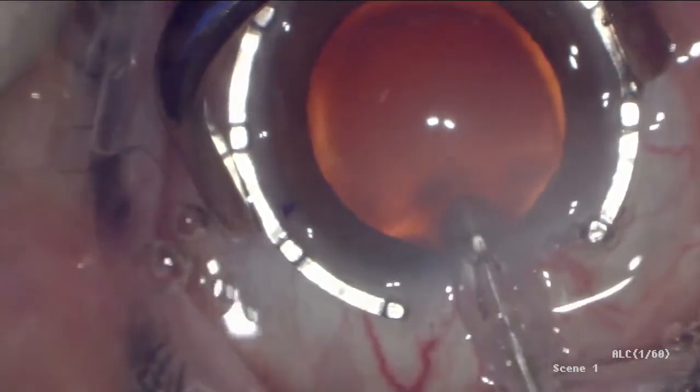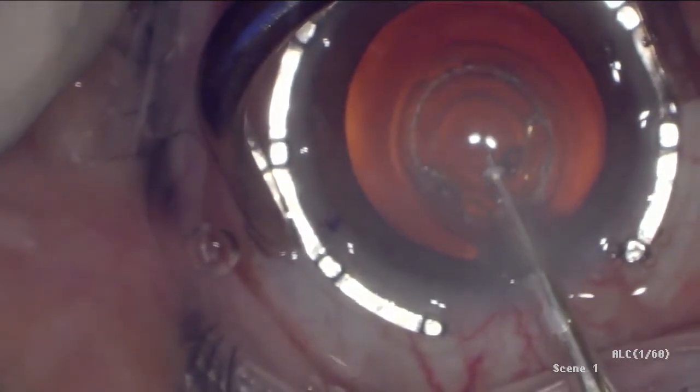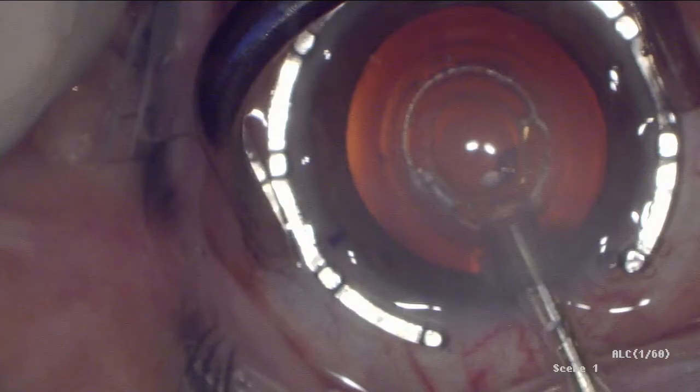Using a Thornton ring, the eye was stabilized and the PPC tip was introduced into the anterior chamber. The push rod was then slid back, allowing the PPC tip to assume its original circular shape. The next step was to position the center of the PPC suction cup at the P1 Purkinje image, which specified the location of the patient's physiological visual axis.